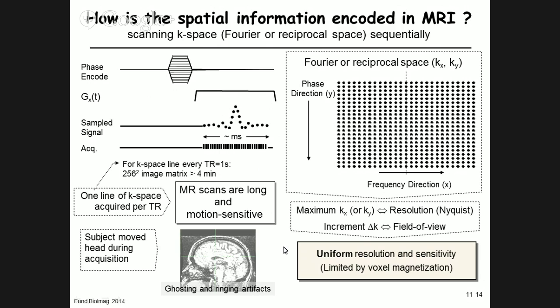Okay, so there's one particular point that's of interest, and that's the center point of K-space. That's this point here, where Kx is 0 and Ky is 0. That's the center of K-space in the image. That's actually where the contrast information is contained. So at the center of K-space, the information about contrast, about relaxation is in there. At the edges of K-space are the fine details of the object.